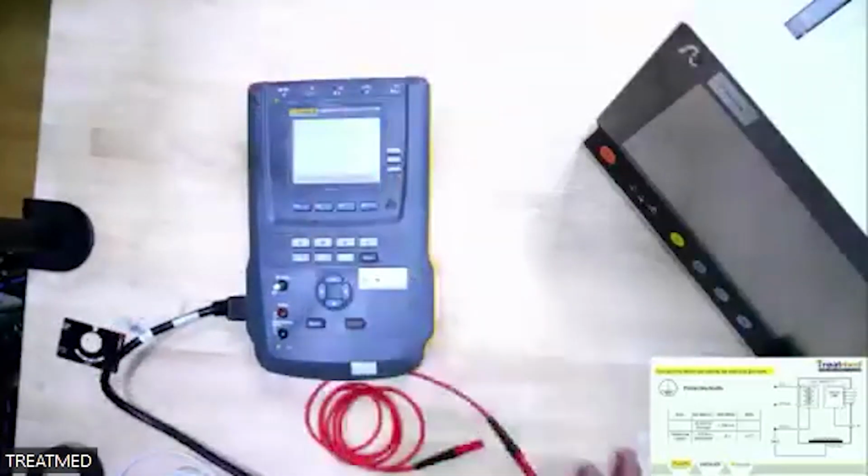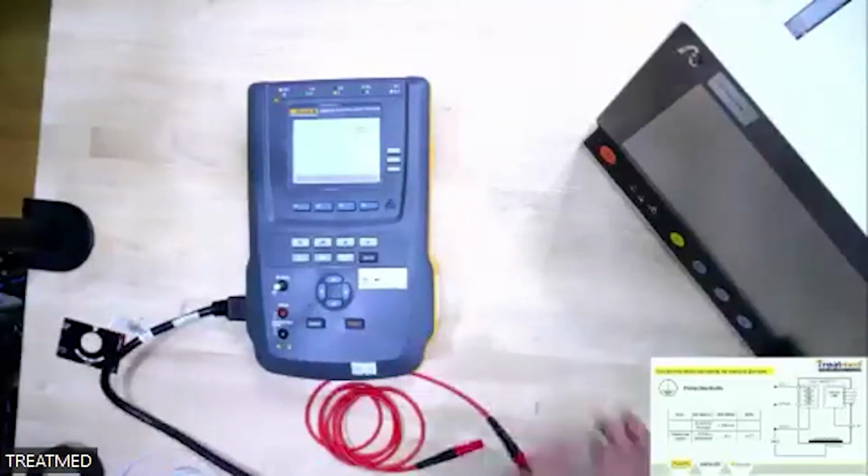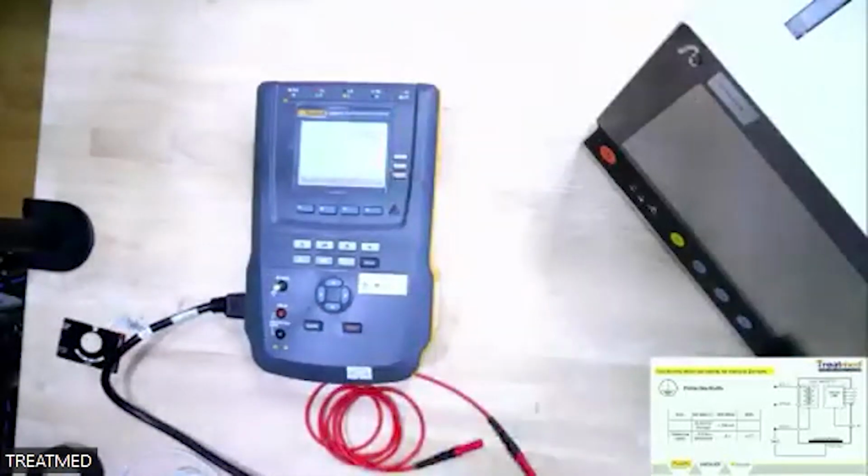Okay, sure. Shall we start the demonstration of how to do electrical safety testing?